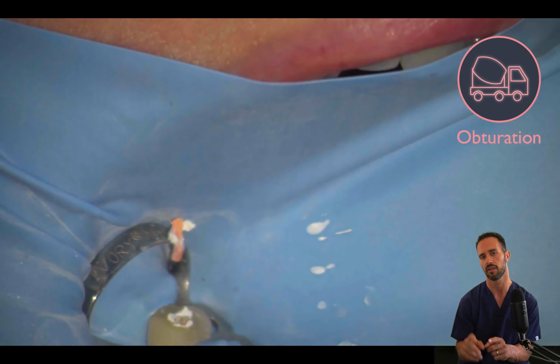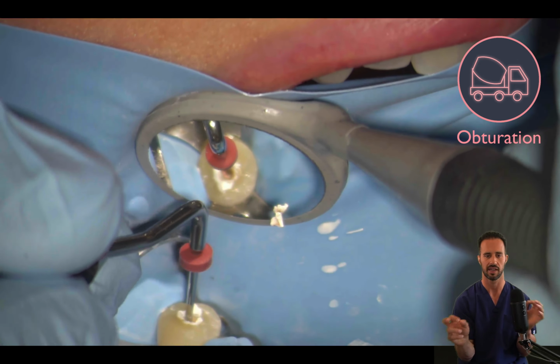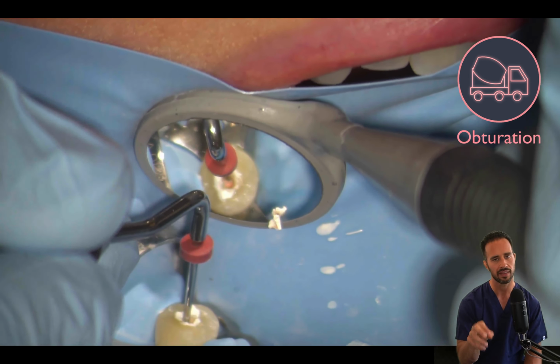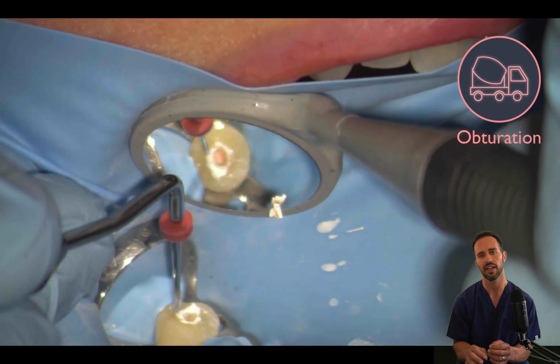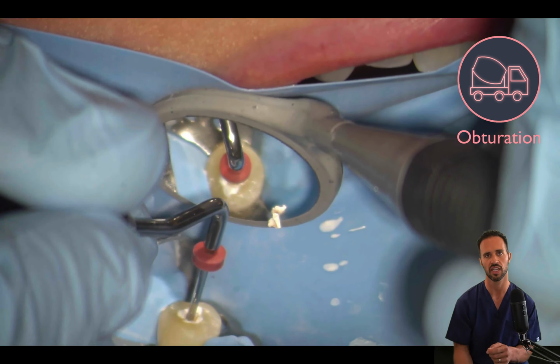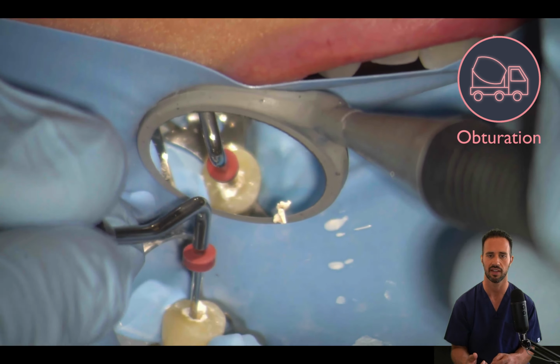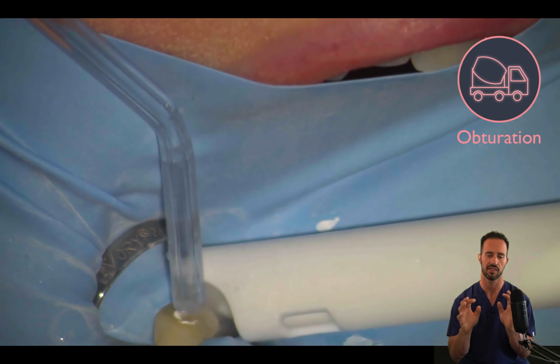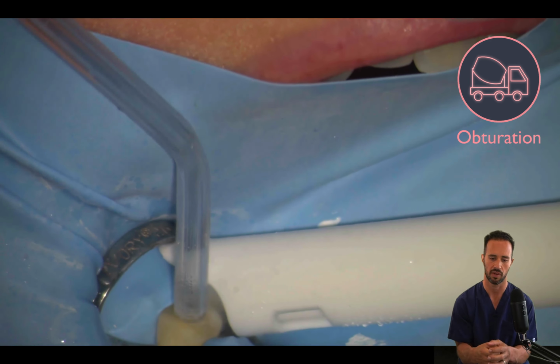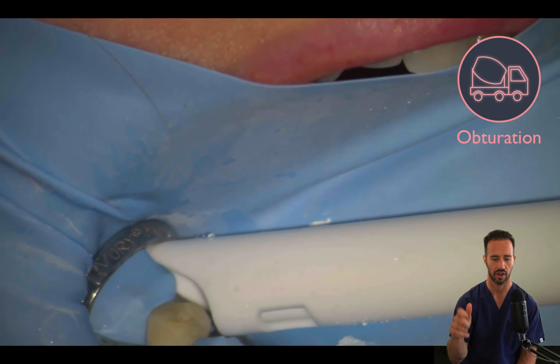I recommend the red and the blue, size 1 and size 2, and they're both double-sided with different sizes on either end. So you're going to compact that gutta percha right at the orifice so you have a nice, neat area. You'll find that removal of the excess gutta percha and sealer is easier on posterior teeth than with anterior teeth oftentimes, just because you don't have so many nooks and crannies, and you usually have a smaller access preparation. But then we're going to rinse off all our excess sealer with your air water syringe. You're just going to spray a lot of water in there. That's going to do the trick.